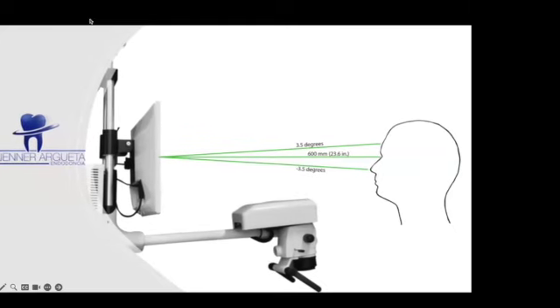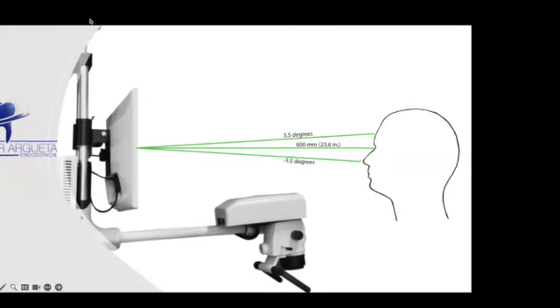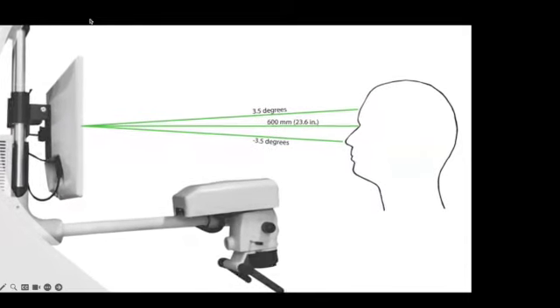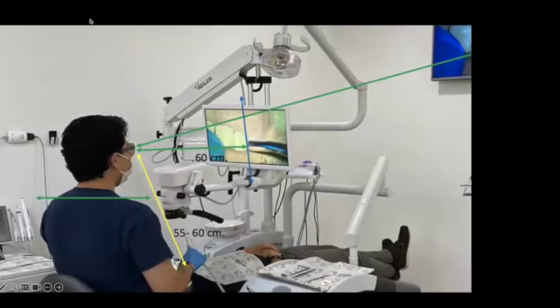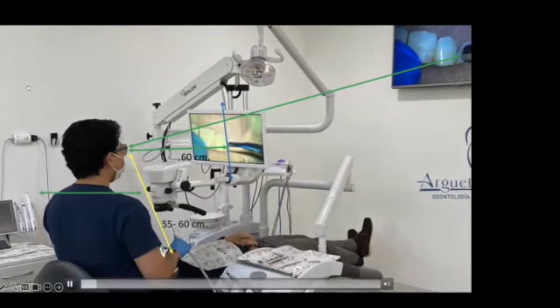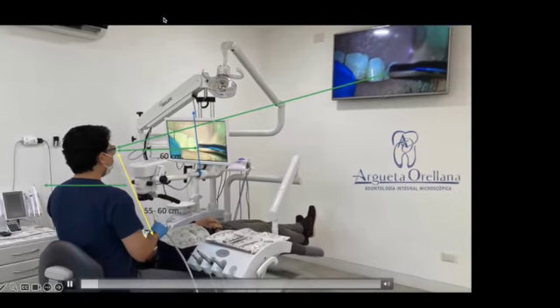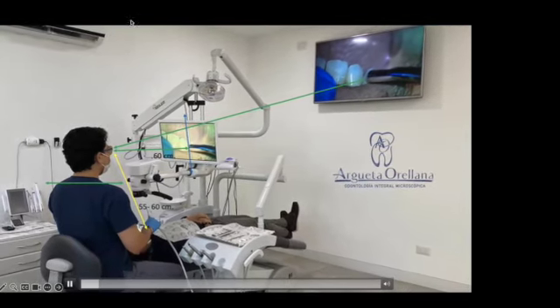For having the best quality of 3D images, the screen should be located just in front of the operator, in a distance of approximately 600 millimeters. The vision of the clinician should hit the center of the screen in a perpendicular direction.